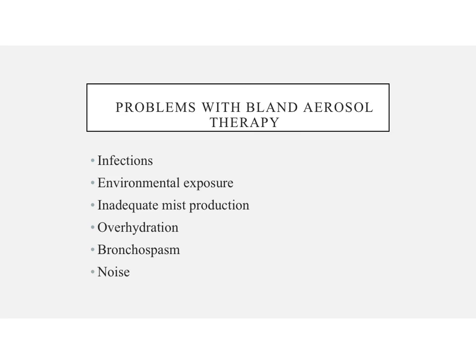Bronchospasm is something else we can run into with bland aerosol therapy, especially if we're using hypo or hypertonic saline. And then noise. Large volume nebs, once we get in the lab, you'll hear how loud they can get, especially if we're using a higher flow. And with infants, it's going to be more common, and that can cause stress to the infants, which can be dangerous. So it's something that you need to be aware of and keeping an eye out for.